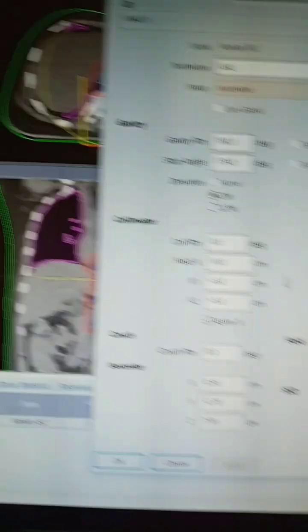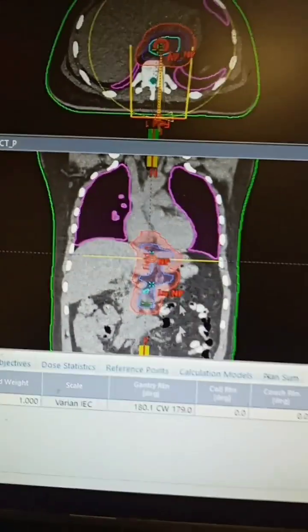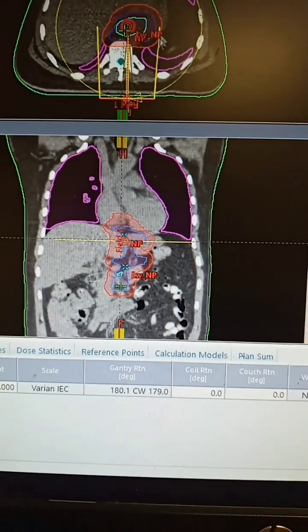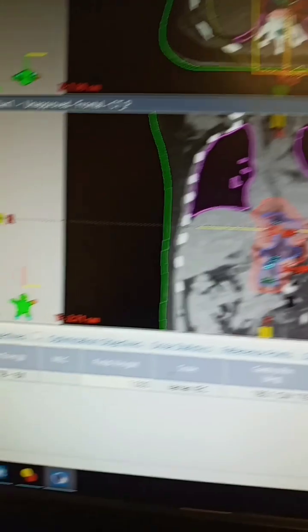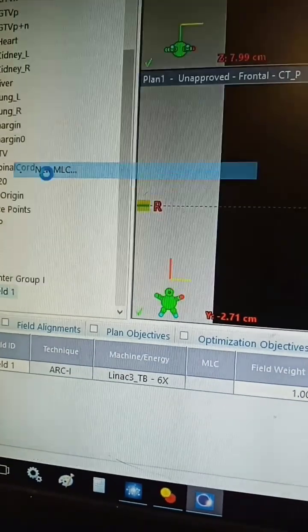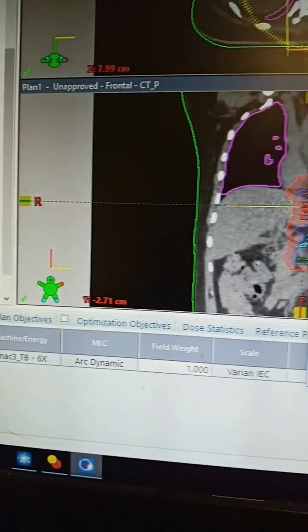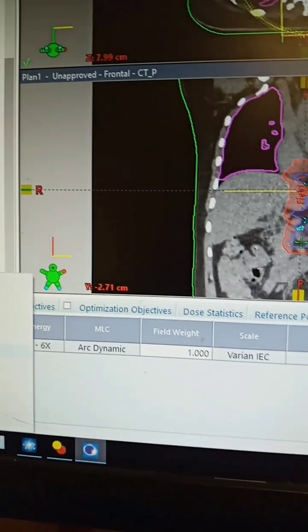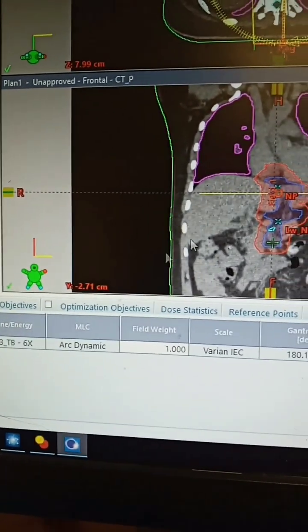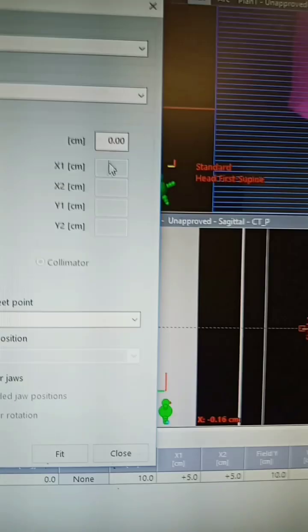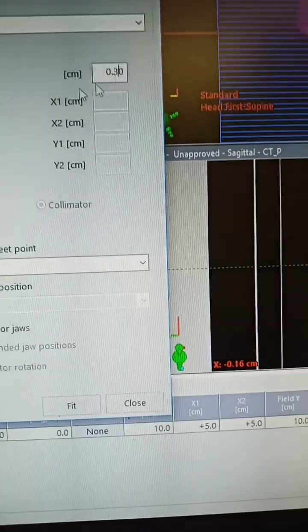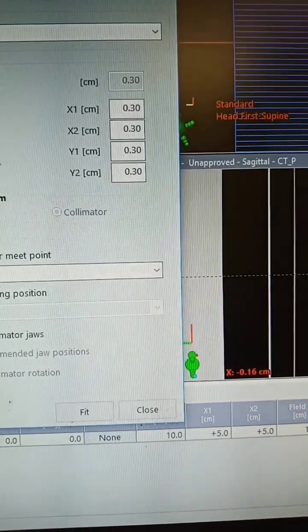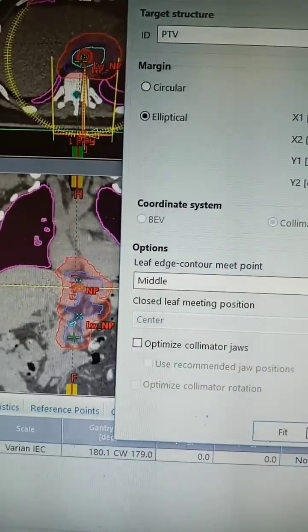Then we're going to insert a new MLC and then we're going to fit the structure. Just give the margins and fit.